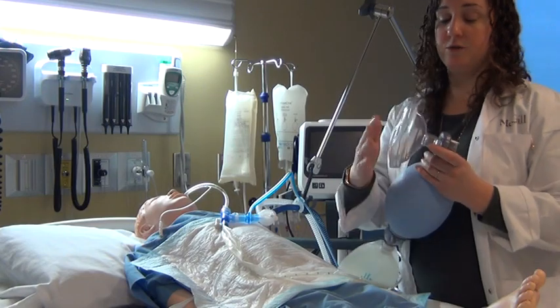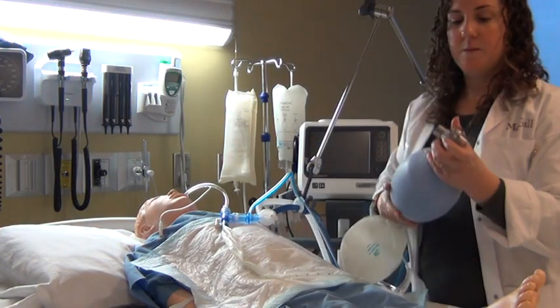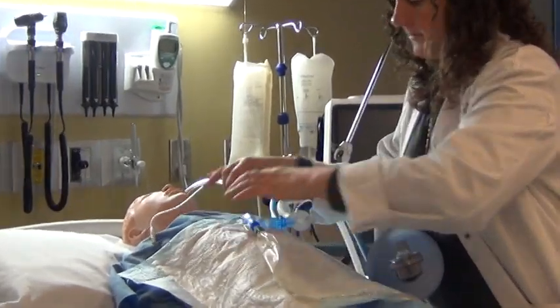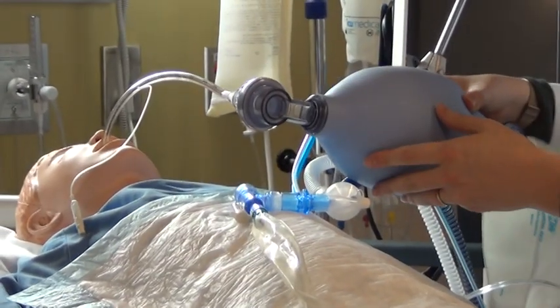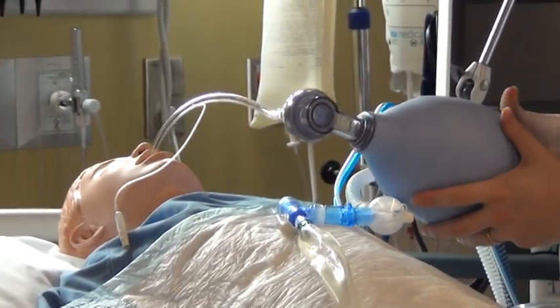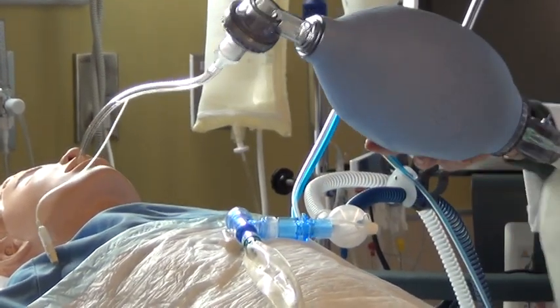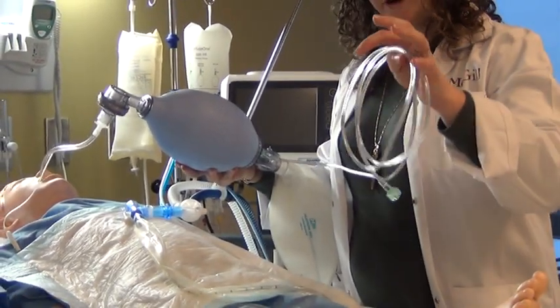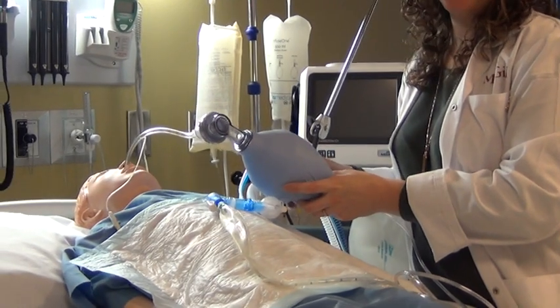Now, if they're not intubated, we would use the face mask. But if they were intubated, there is a way to connect this bag directly to the endotracheal tube. So this is a possibility, and then we would just provide the ventilator breaths this way. Now, obviously, this needs to be connected to oxygen, so do not forget to connect that. Turn your oxygen on when you're providing these breaths.